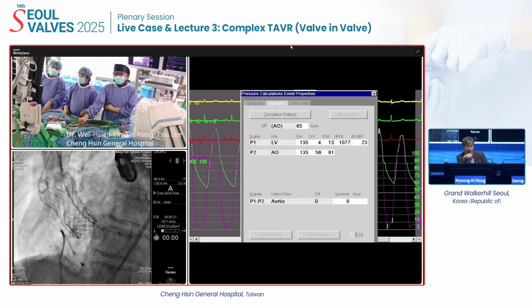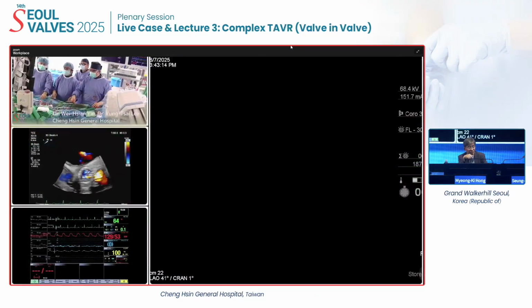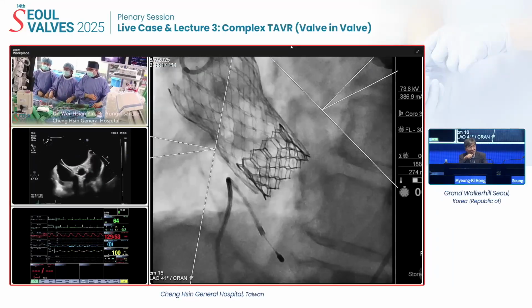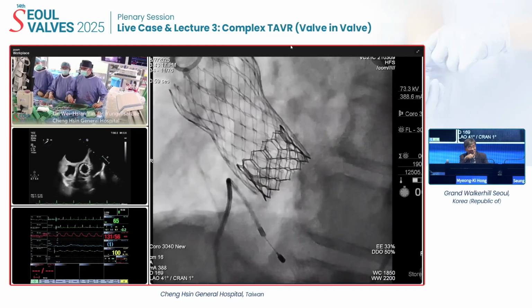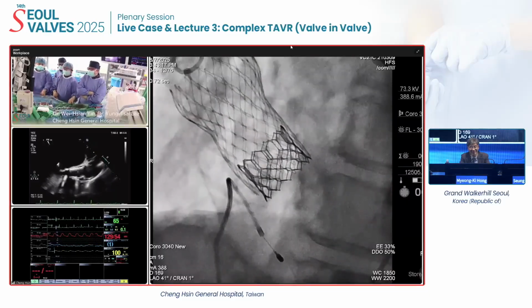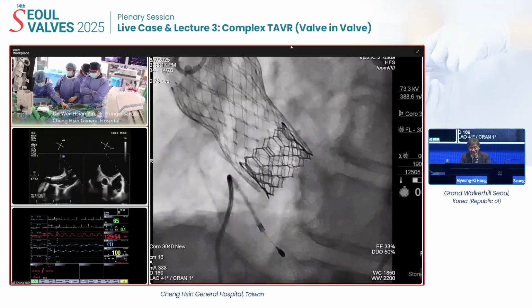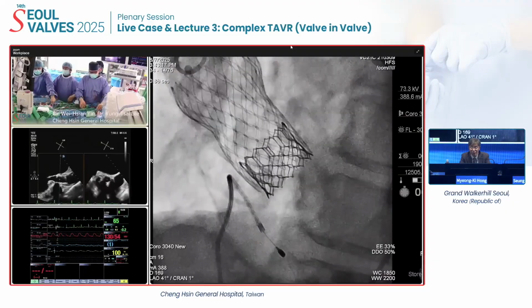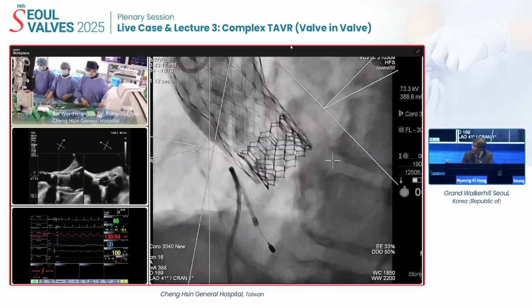Excellent. I'd like to thank you for the very special and educational case, and your team, Dr. Tsai, correct? Dr. Cao, Dr. Lee, and me. Yes, you suddenly appear. Okay. Anyhow, it's a very nice demonstration, and I really appreciate the great contribution to the SEOUL valve live cases. Any comment? Any comment?